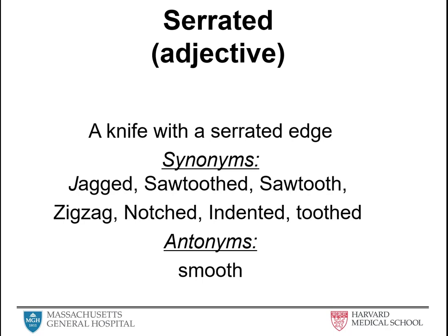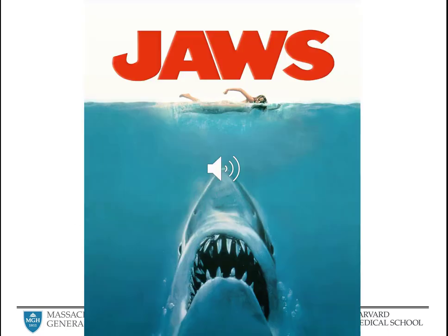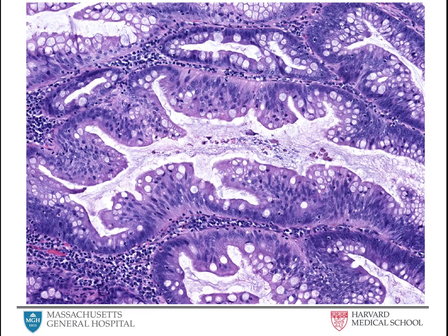Serrated refers to a knife with a serrated edge. This here is the classic serrated pattern. I'm not sure how many of you guys remember this movie. This is what you would see under the microscope.